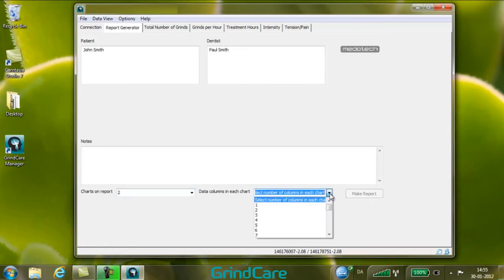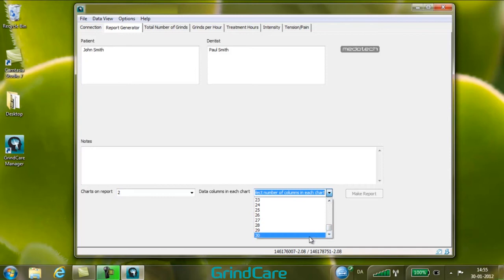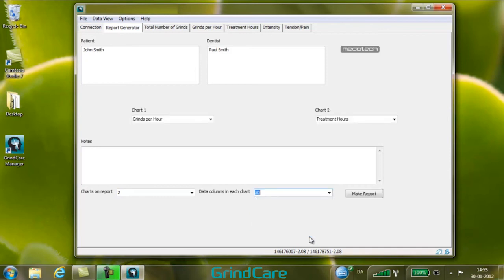After selecting the number of bar charts to be displayed, the number of bars or nights to be displayed in each bar chart can be selected. If one or two charts have been selected, each bar chart can show up to 30 bars. If three or more charts have been selected, each chart can show up to 14 bars. If there's more data recorded than selected to be shown, it's always the newest data that's displayed.